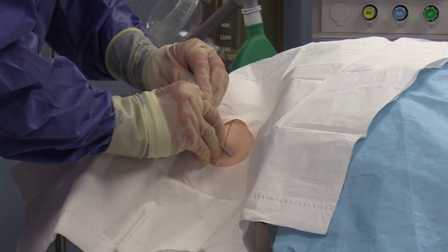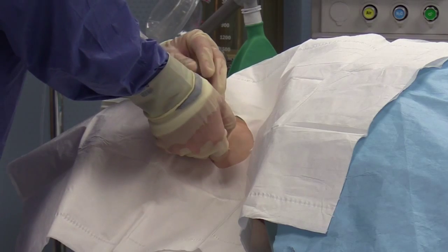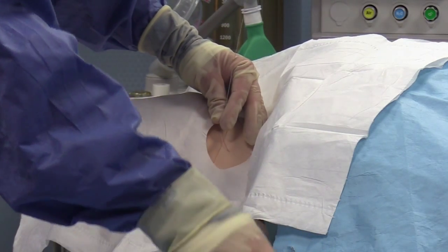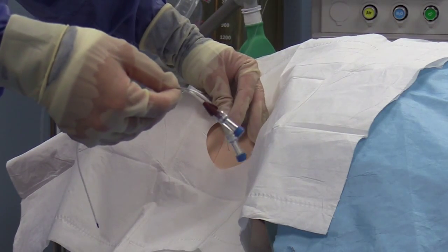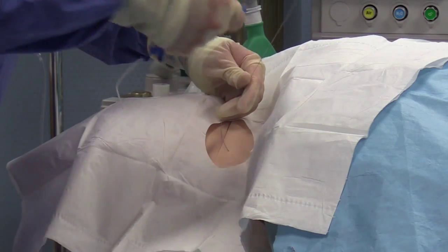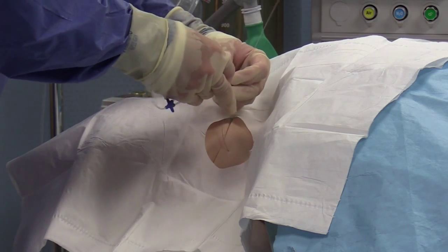Insert the dilator over the guide wire. Be sure the dilator will move through the neck structures flush with the skin line. Remove the dilator, again holding onto the guide wire from above or below as allowed. Take the central line catheter and remove the cap from the brown port. Clamp the other ports.